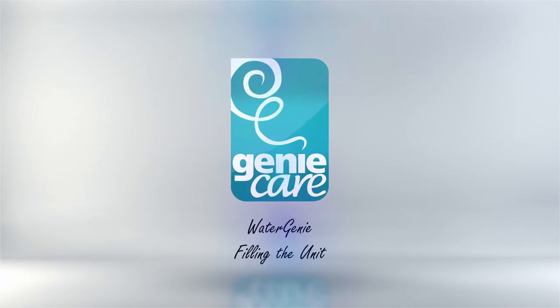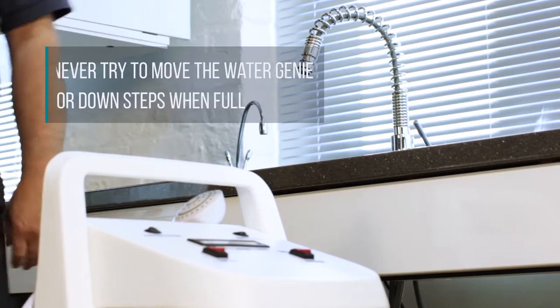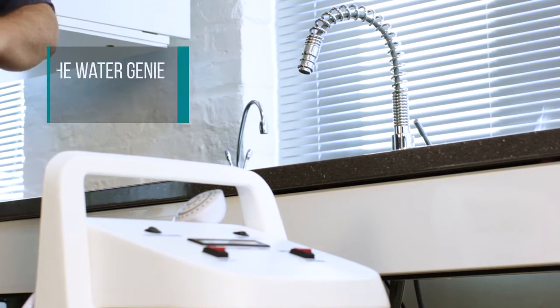Filling the unit. Bring the Watergenie to the water supply such as the kitchen. Never try to move the Watergenie up or down steps when full.